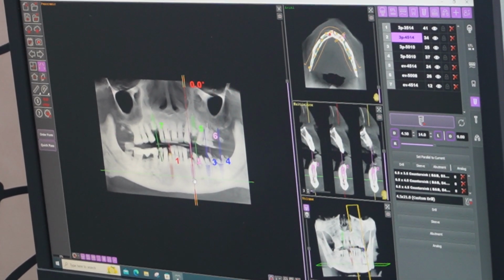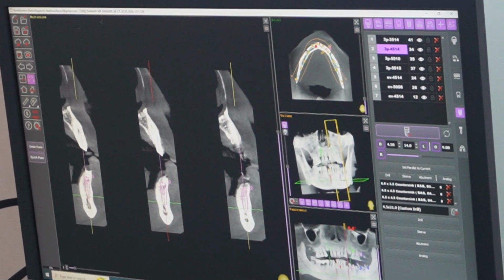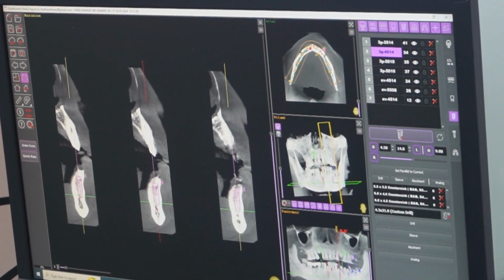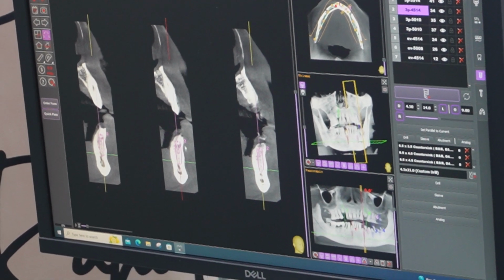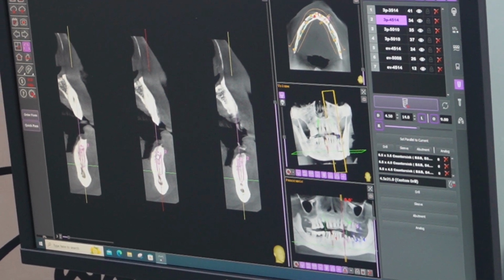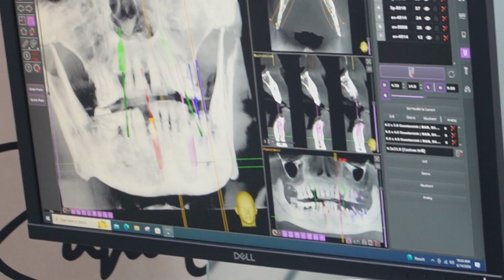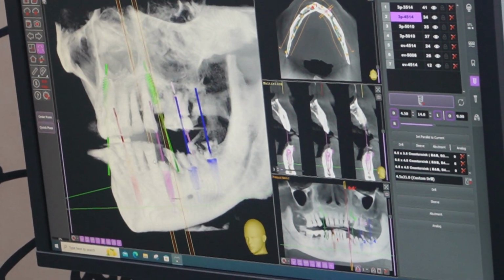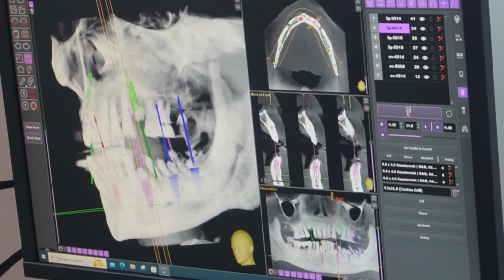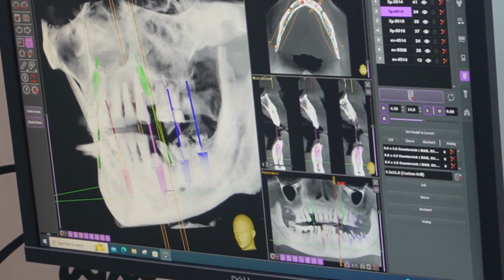This is the same size and same width of the implant by the same company which I am using today. So the width and length of the implant which I am using can be placed virtually here, and in cross sections I can check whether the length and width are proper or not. The same thing can be checked in 3D images, where the alignment and the level of the implant, look at the level of all 4 implants which are planned, are at the same level.